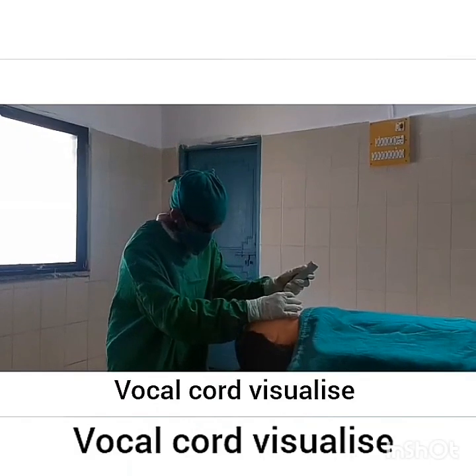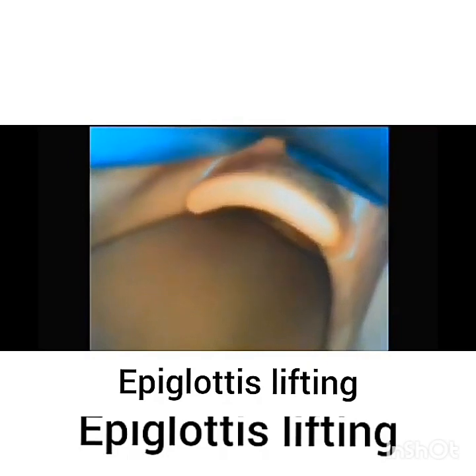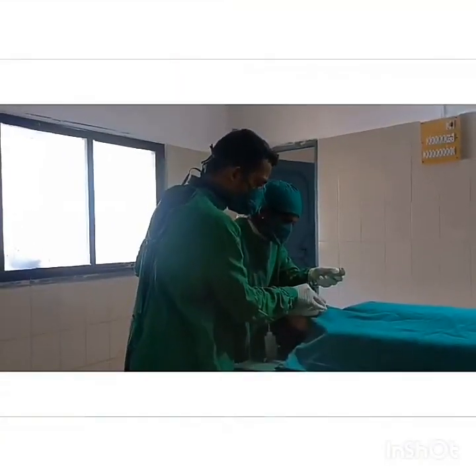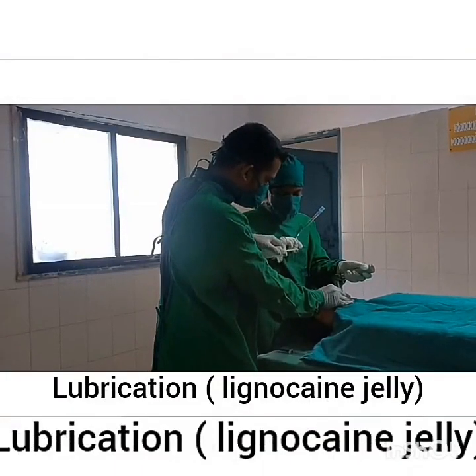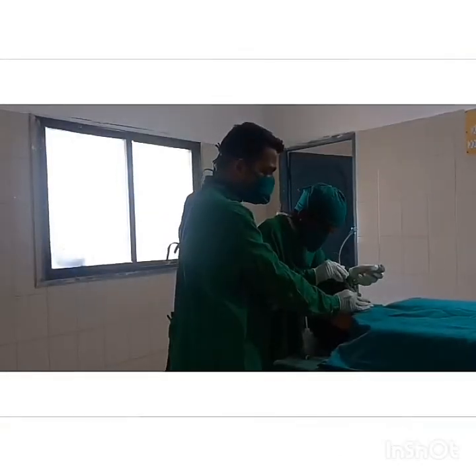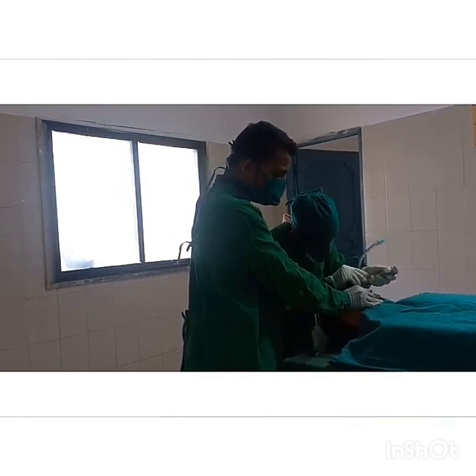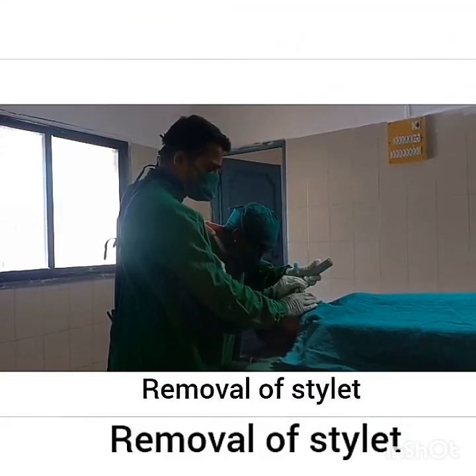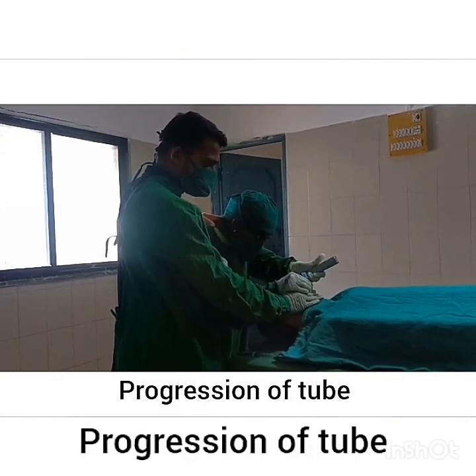Epiglottis lifted, vocal cord visualized. At this time, a second helper provides cricoid pressure. ET tube insertion. Tube passing through the vocal cord. Removal of stylet. Progression of the tube.